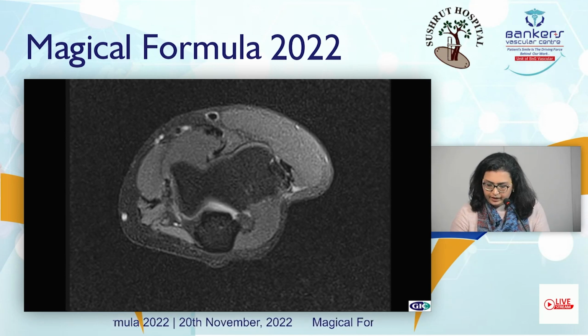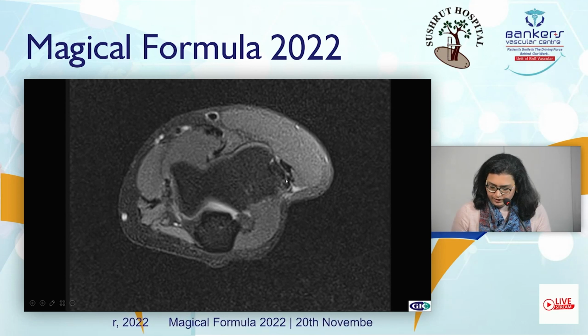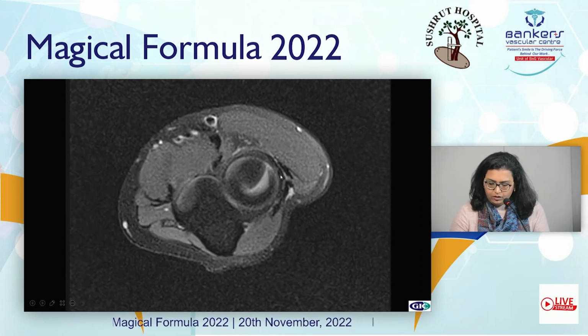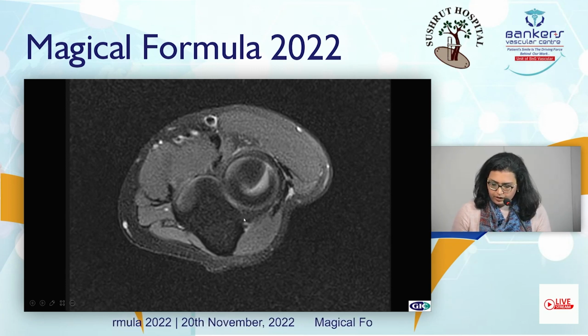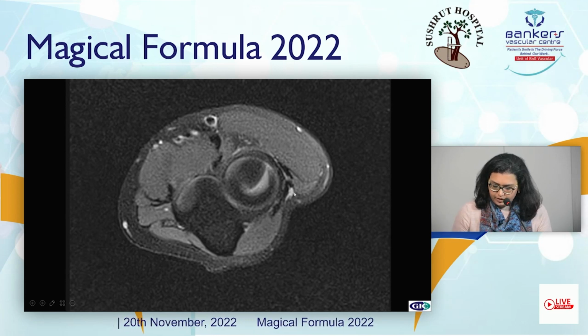This is a typical common extensor tendon origin, wherein the anterior tendon is the extensor carpi radialis brevis, which is the first to tear, and then there is the digitorum. Underneath is the ligament complex, that is the radial collateral ligament, and the posterior component is the lateral ulnar collateral ligament that inserts into the ulna, and these are the extensor tendons and their myotendinous junction.